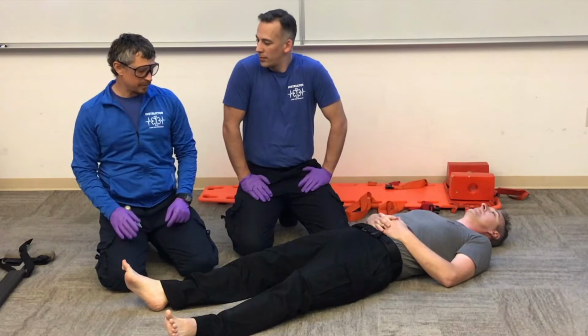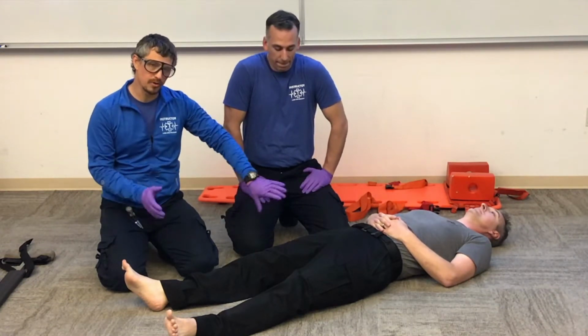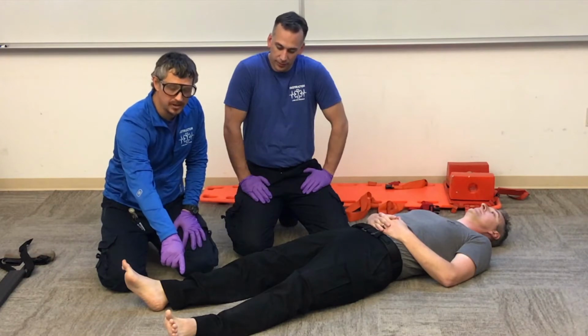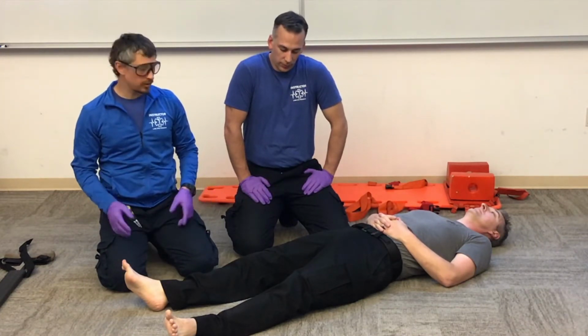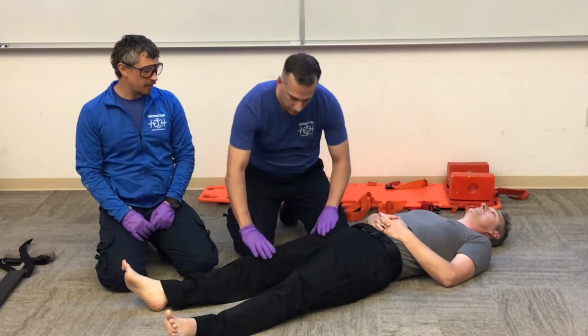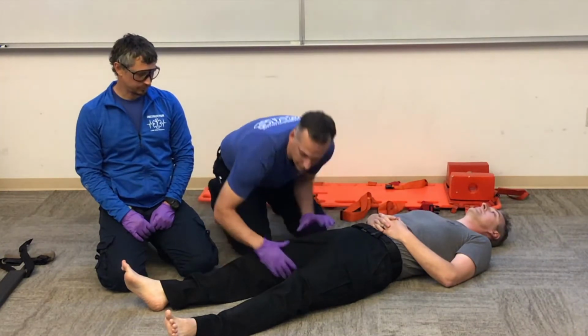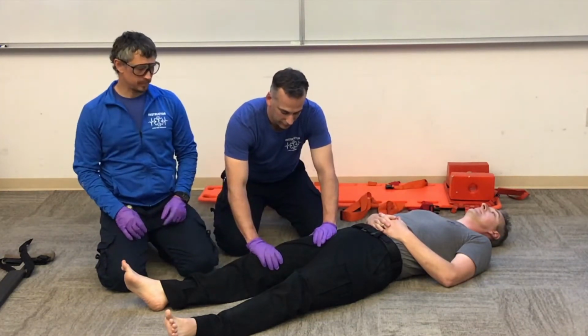For our midshaft femur fracture, a lot of times we'll notice that the leg is shortened or rotated. We'll notice that in comparison to the good leg. First thing we're going to do is have our partner Nathan hold manual stabilization of the injured extremity. So he wants to hold above and below the break.